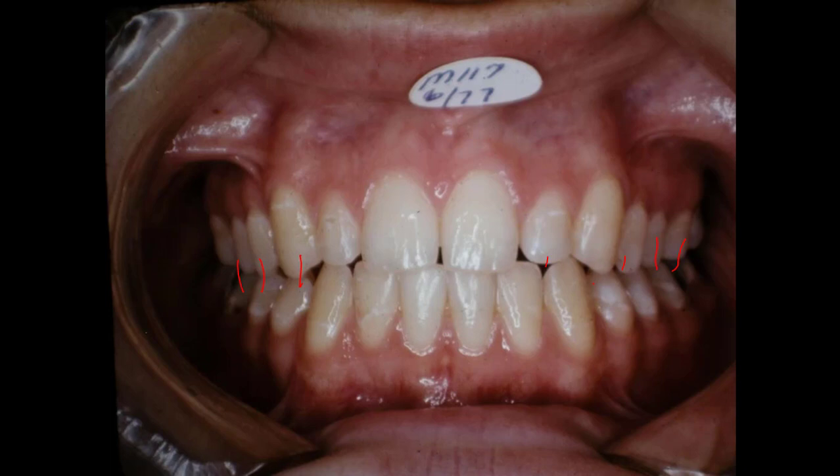To think you started out with what I've shown you over there — that was incredible that you could take orthodontic appliances and come out with something like that. And that young lady will have a totally different life. It would be hard for her to accomplish what she is capable of doing with a set of teeth like that.